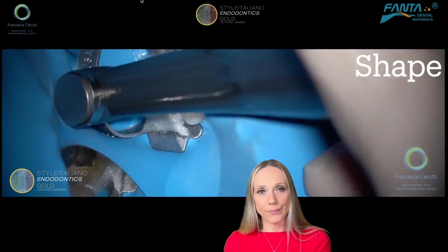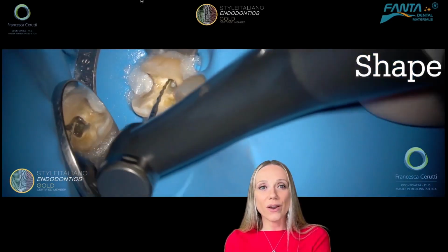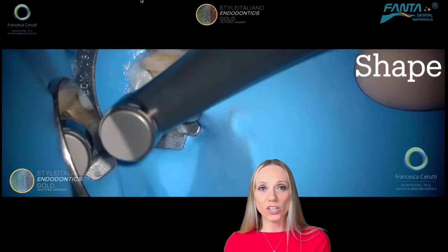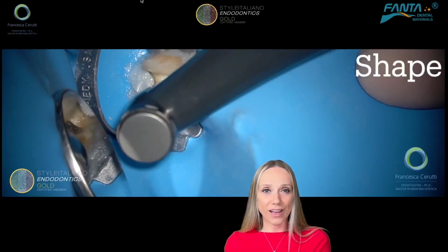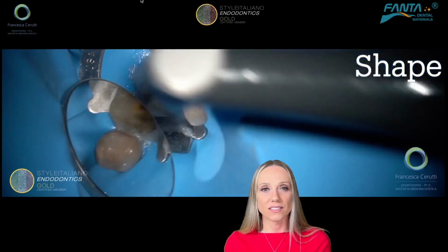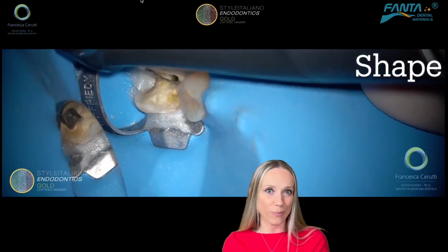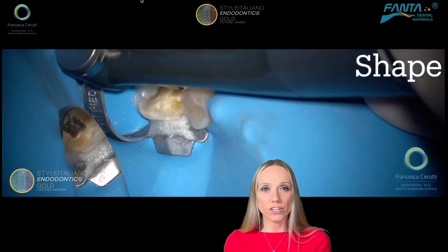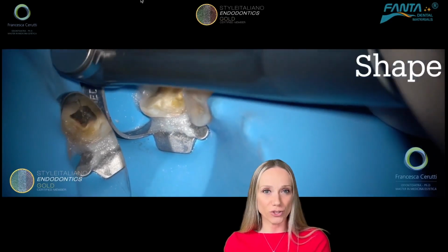the root canal system. And modern endodontics allows us now doing these steps in a very short time and allows us being extremely respectful of the original anatomy of the root canal system, because nickel titanium files are available in a variety of sizes and designs and heat treatment, etc. But this is not the topic of our lecture. These files allow us being extremely conservative and fast and effective in the phase of shaping the root canal system.